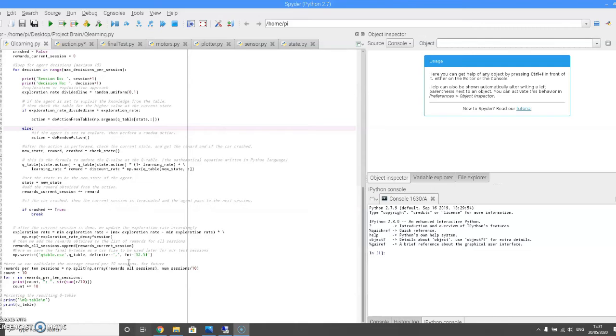After a session is completed, we update the exploration rate, add the amount of rewards from the session to the list of rewards from all sessions, and save the current Q-table created. Once all sessions are completed, we print out the average reward per 10 sessions and we print out the resulting Q-table.